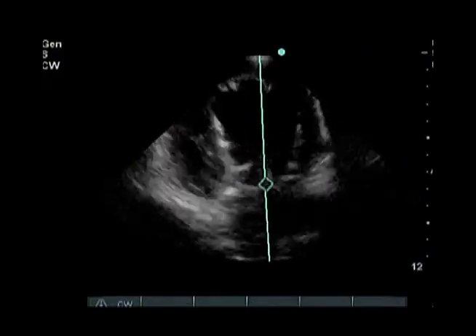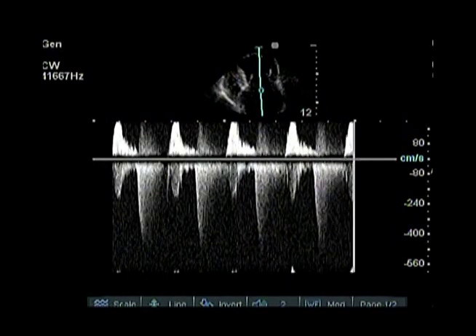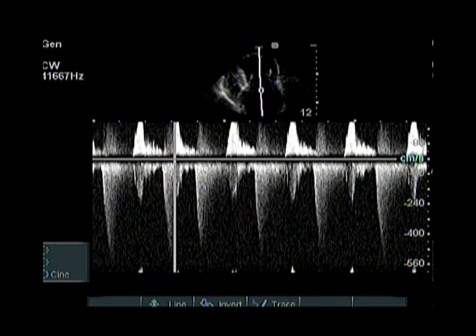If you are seeing washout, the spectral Doppler cursor is not in the direct flow of the lesion. In some cases, it is not possible to place the cursor in the direct flow. Color flow Doppler will help you locate the flow of the lesion.